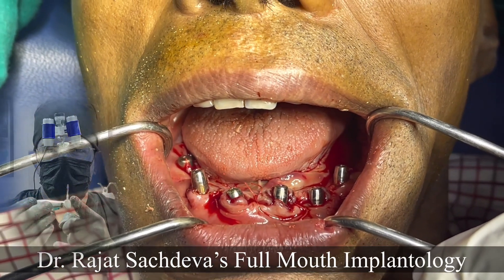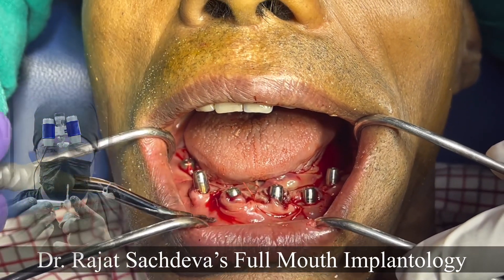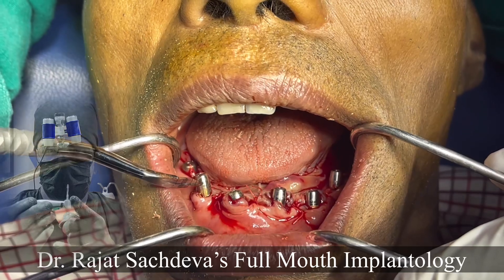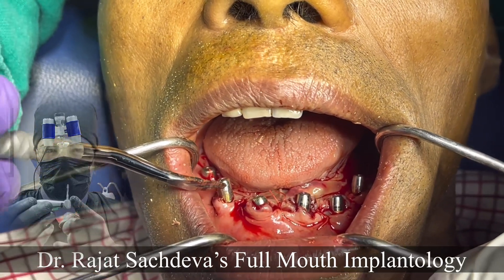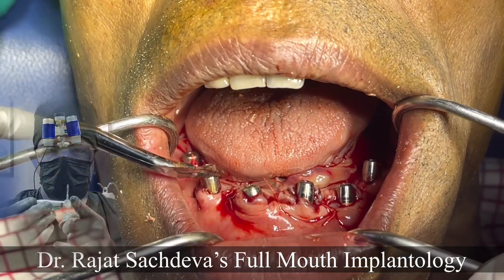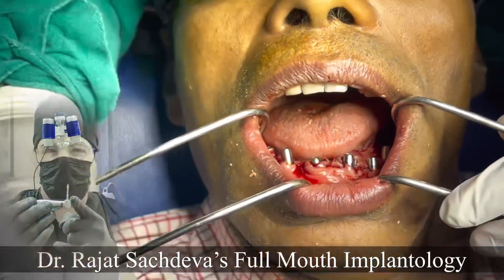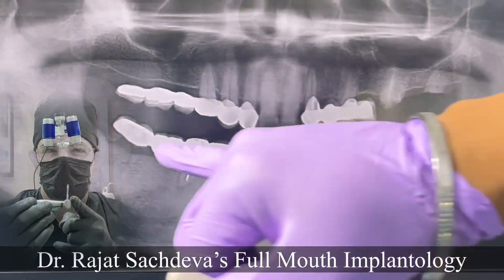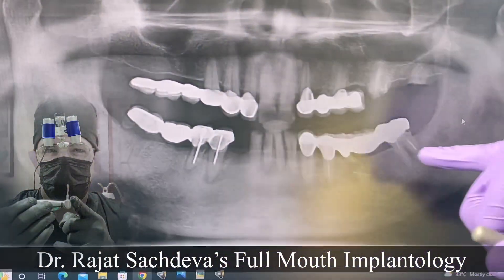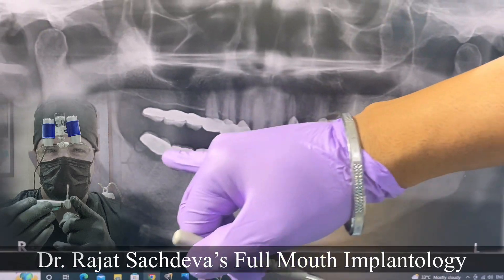With balanced occlusion, you need to be able to extract — from implant placement to impressions to jaw relations. Make sure that you have extractions. You can see in the OPG. You have to maintain the lingual cortical plate.